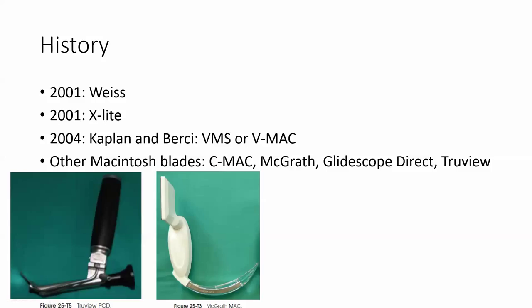And briefly, this technology was developed in the beginning of the 2000s, and a couple of early laryngoscopes that had the ability to show the glottis on a screen or through a light tube or such included the TrueView and the McGrath.